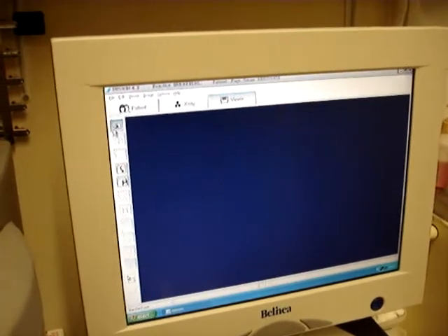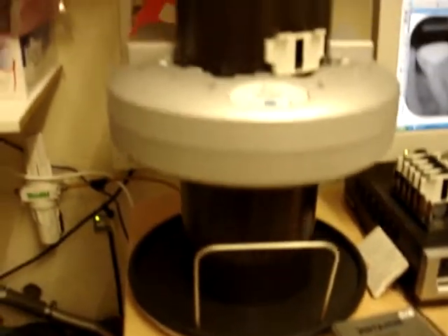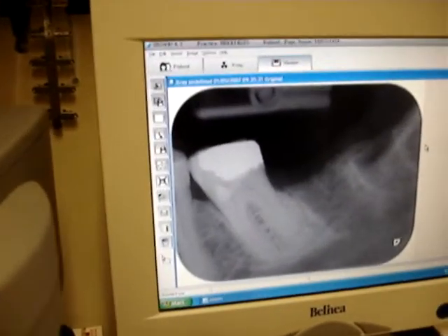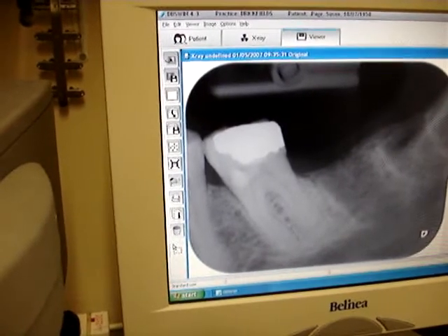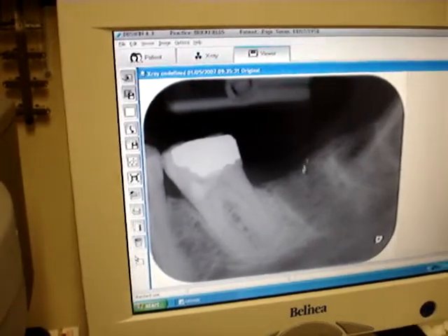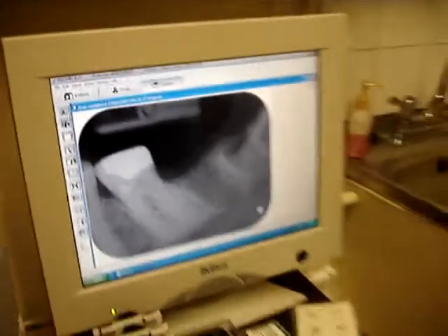And for the smaller films — if you're looking at this one you're getting that... this is what, 12 grand, you say, this little setup here? It's still not a huge amount, is it? Look at that — you've got huge, wonderful detail. Show me what you can see on that. Big amalgam — no overhang. Big root. She's had two recent extractions in the area there. So in the old days she would have had to have a denture, which wouldn't have been great because there was nothing to support it at the rear end — it was a bit of a gum stripper.